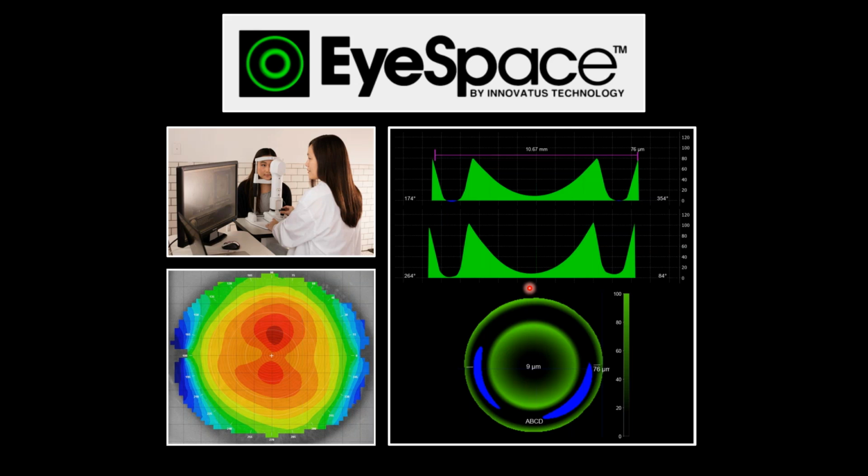Using any kind of nomogram that takes K readings just doesn't make sense today when we have the ability to use thousands and thousands of data points and then place a lens on in 3D space and then adjust for any areas that we want to soften the landing, any areas where we have excessive fluid or inadequate fluid. So this is really the best way to build a rigid contact lens.